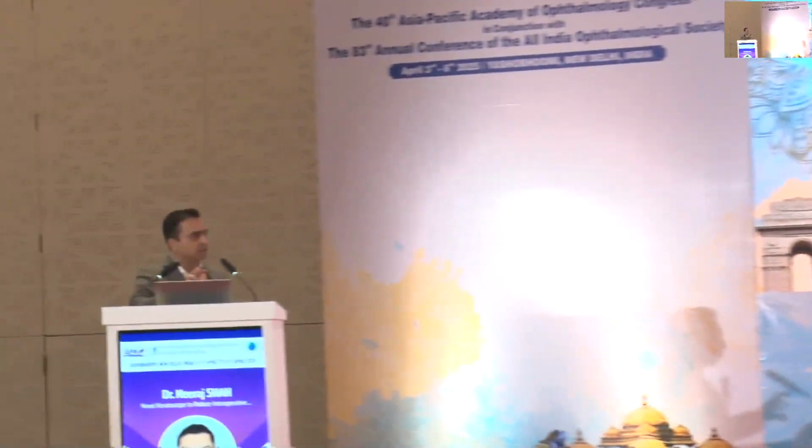No, just thinking out loud, you can use image guidance. And how big is it? Is it difficult to mount on the microscope? No, it's very easy. What we would really need is to find out the working distance and just put it in that formula. So suppose the working distance for your microscope is, let's say, 150 for example. Then we'll find out the diameter. It can be plugged into any microscope at the objective level and it should go.